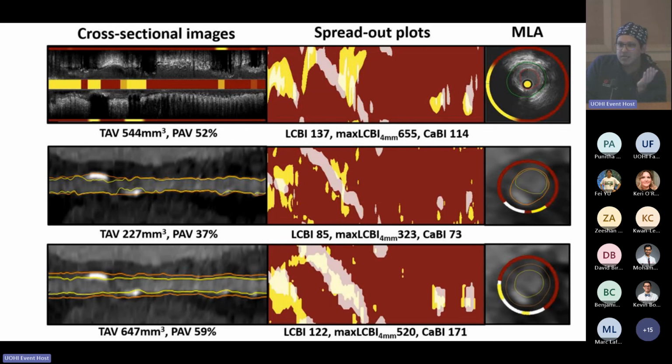And that's the single most important metric for lifetime risk of MACE of all the ones we've talked about. And this is with an expert drawing it. So it's not just the characterization, it's how much plaque you just can't see. I do think CT is the future, but where the modality is right now, even two experts would disagree with each other about how much true plaque, fibrotic plaque, this patient would have, for instance.